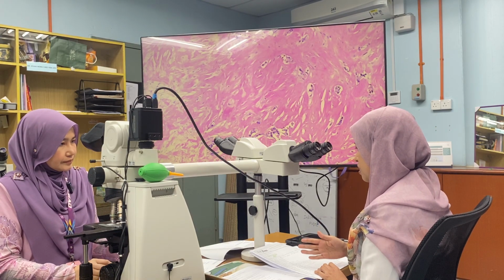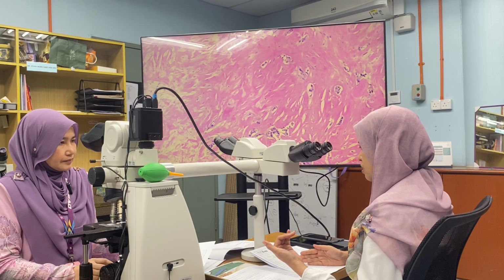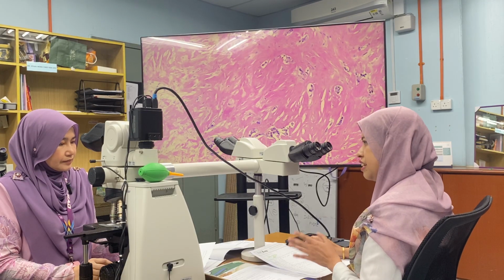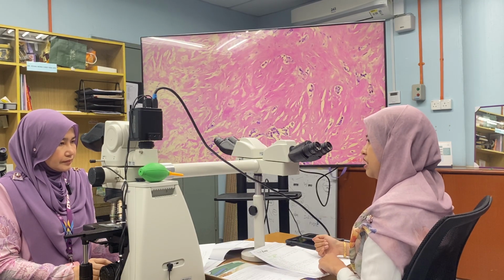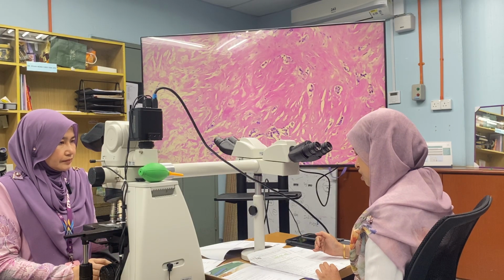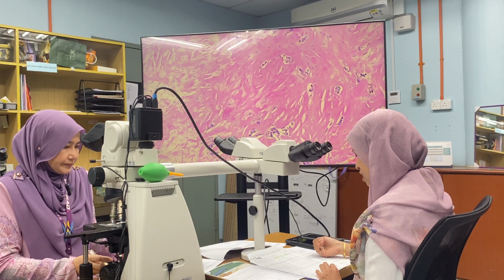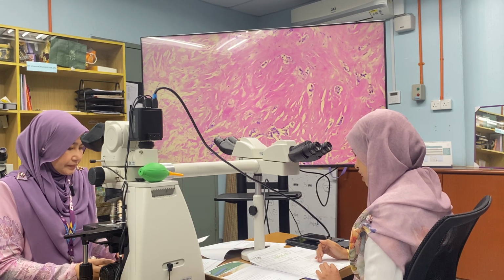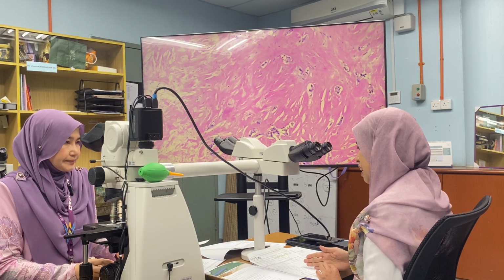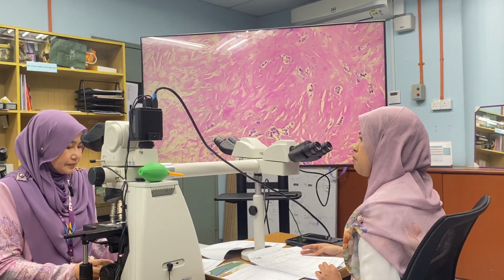Also, upon serial cut section, there is another fibrotic tissue on the outer upper quadrant, measuring 15 x 10 mm, and the second lesion is 10 mm from the first lesion. So I submitted the breast tissue as follows: superior margin, inferior margin, medial, lateral, with the nearest superficial and deep, and also representative sections from the lesion and the second lesion, as well as the nipple areola complex.